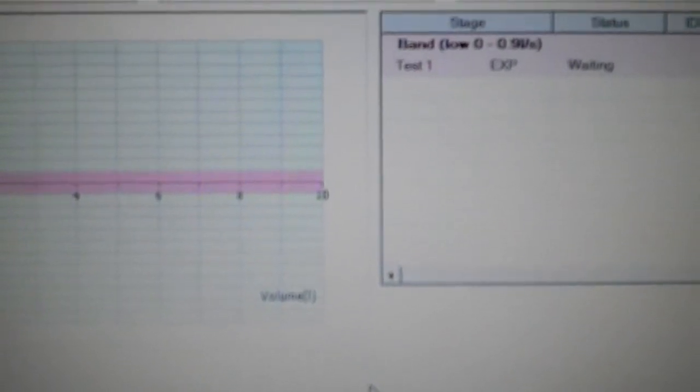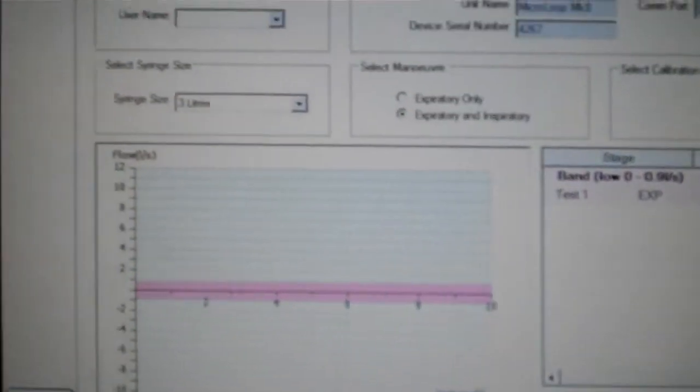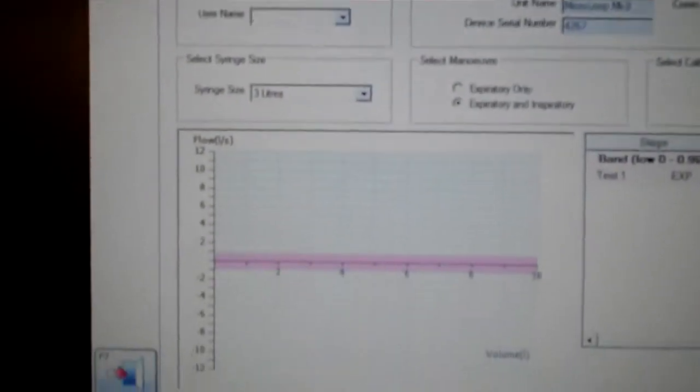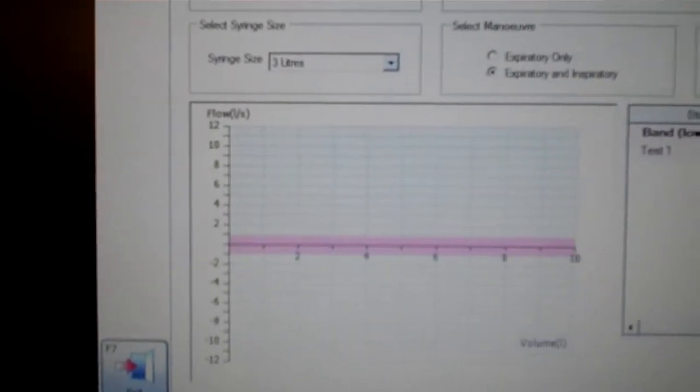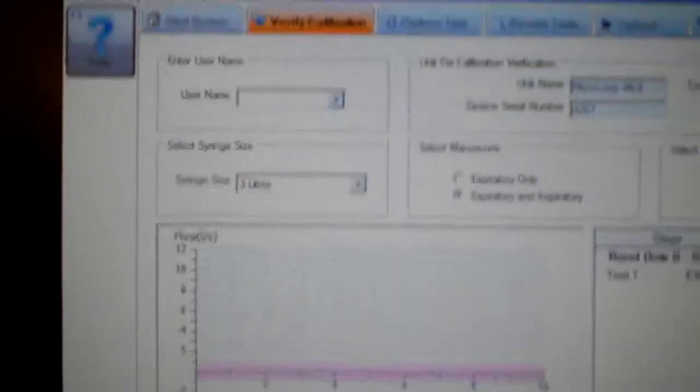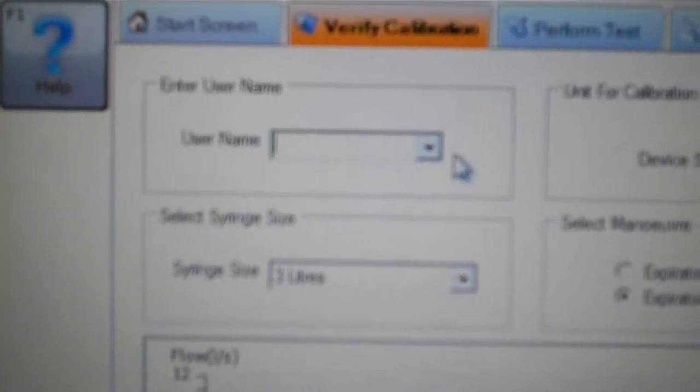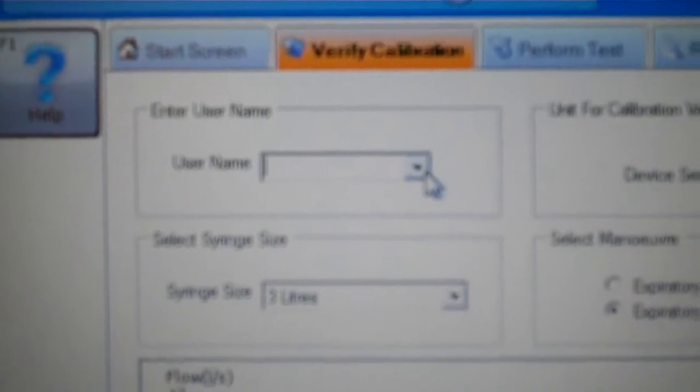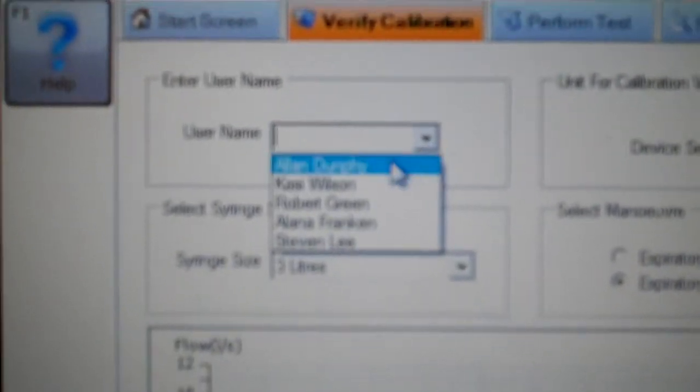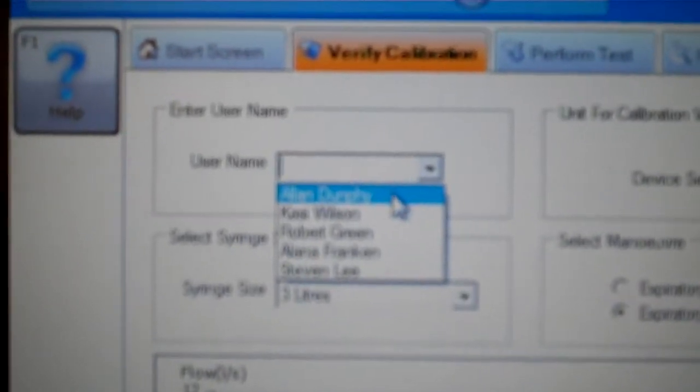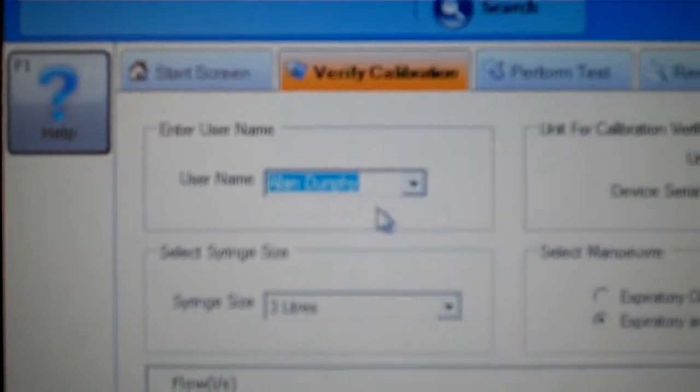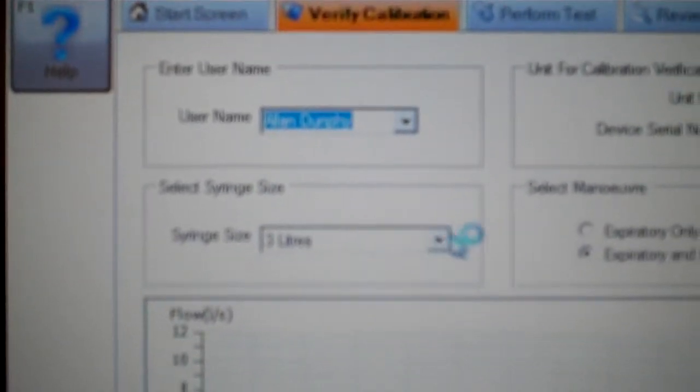When I verify calibration, you will notice that a screen pops up, and the first thing I have here is user name. My name is already entered in here. You would place your name in there. Mine is Alan Dunphy.